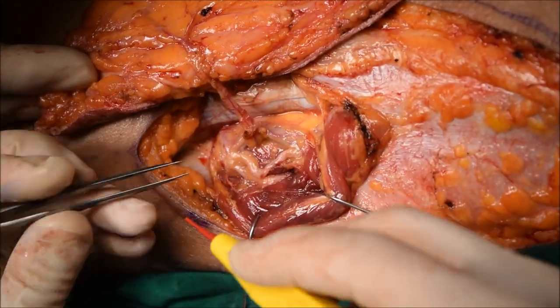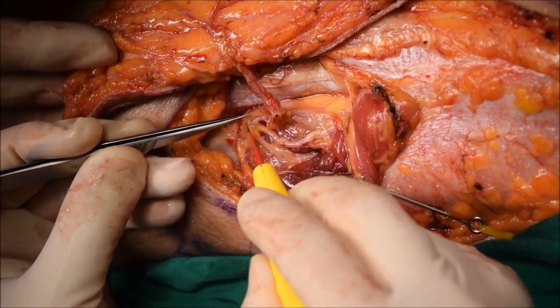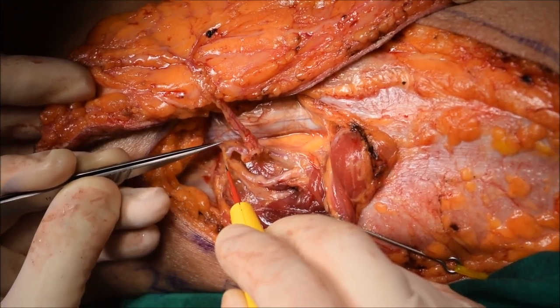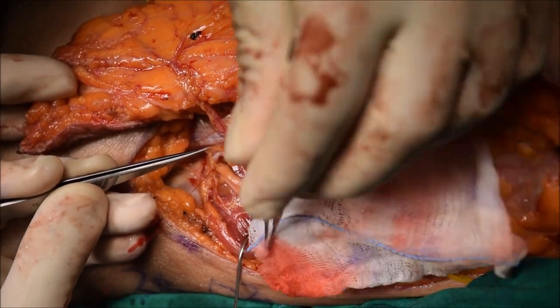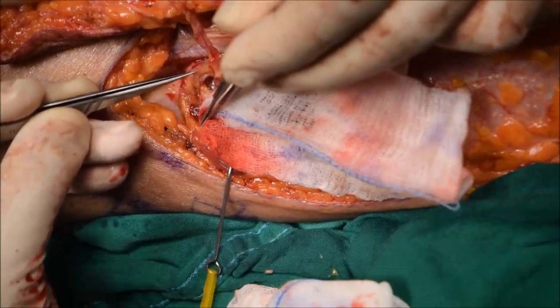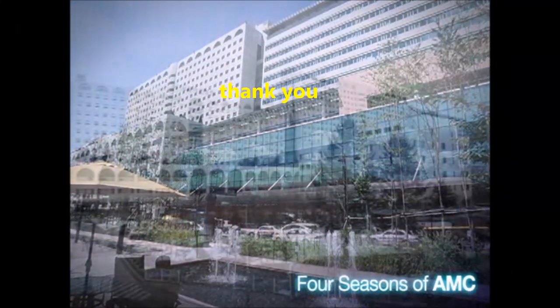Now the flap is passed through that splitted muscle portion, and you can see clearly the pulsation of the perforator entering through the muscle and entering into the descending branch. So this has been our experience — using the monopolar bovie really allows efficiency and allows better vision. But of course, bipolar is needed to coagulate large vessels as well. Thank you for your attention.